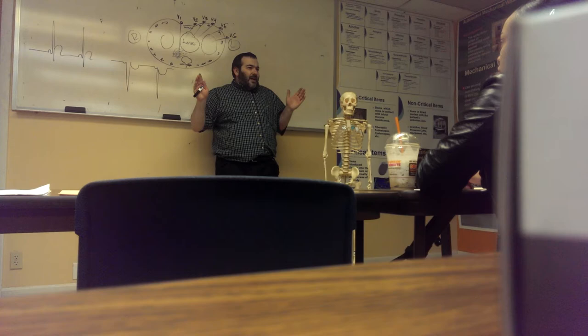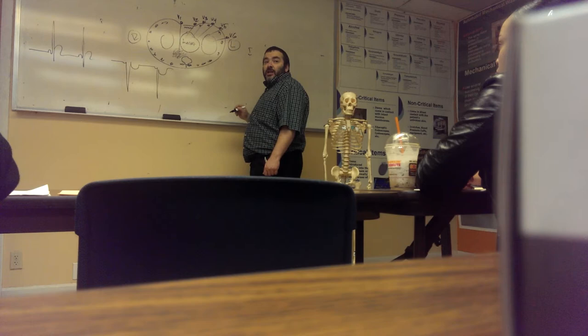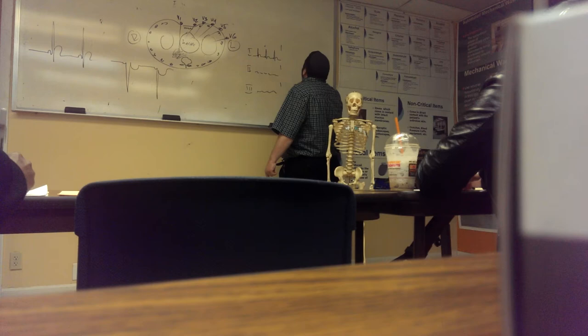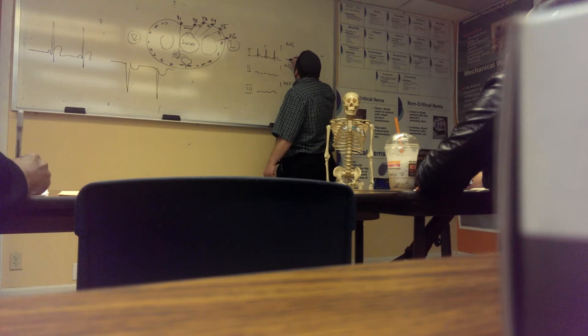Are you catching my drift here? Yeah. Now, here's how the EKG looks. When we print out the EKG on a piece of paper, the first set of scribbles we get will be like this. Usually we'll get just a few beats. Then number two will be over here. Number three will be over here. Then you have a little line. And then you're going to start with AVR. The next line will be AVL. And this one will be AVF. So we're going to get a squiggly line. I'm just going to draw one. AVR will always go down.